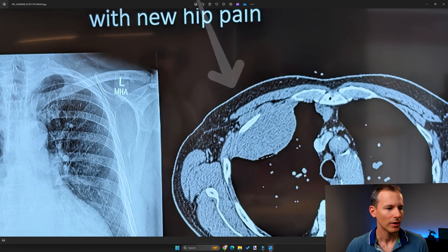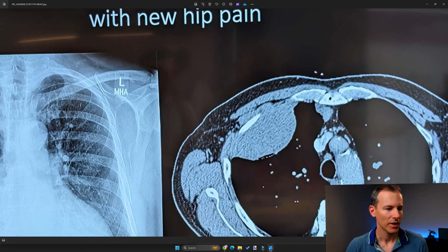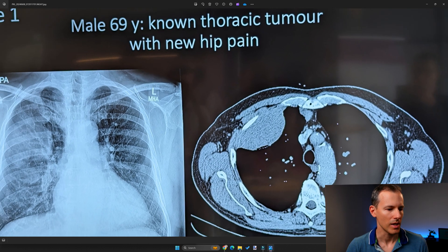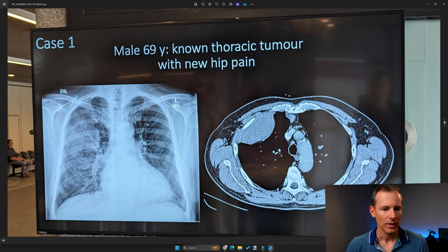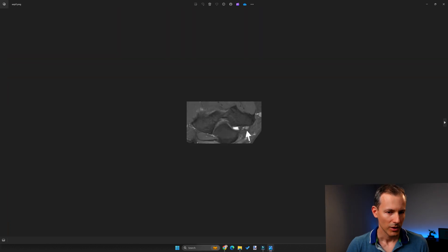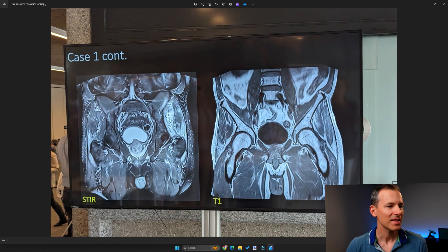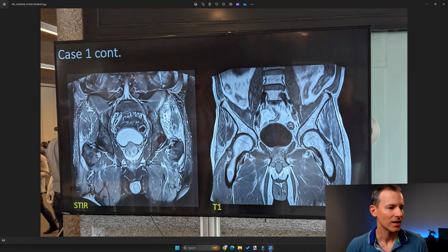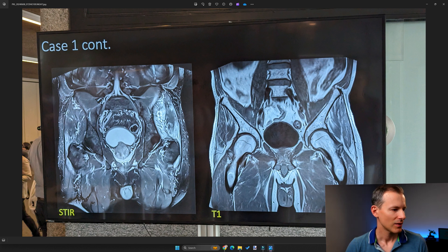That rib sclerosis was something pointed out by the panel — I didn't see it myself and I don't think it made a big difference in my reasoning. Now, they provided a second image: an MRI of the pelvis in two planes — a T1 and a STIR image.